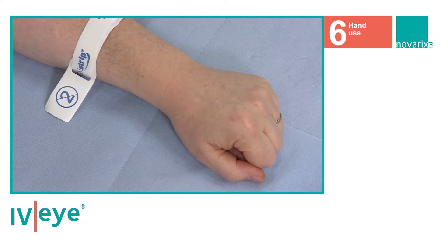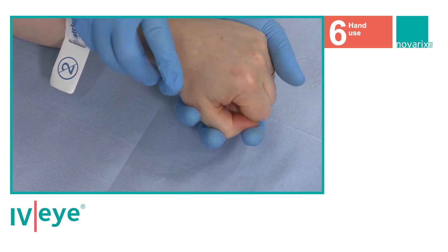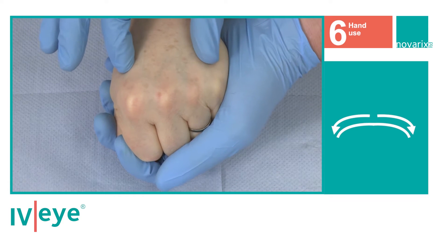Using the IVI on the back of the hand, hold the hand firmly from underneath and squeeze slightly, pulling the skin as shown to reduce the possibility of veins rolling.